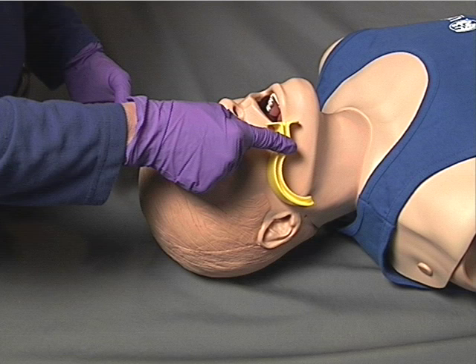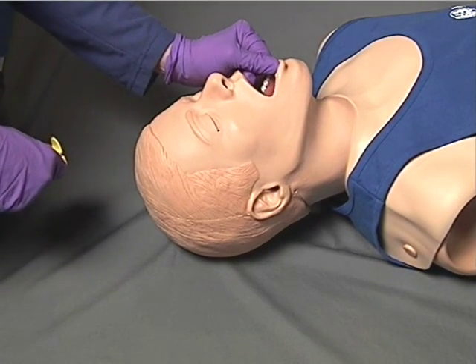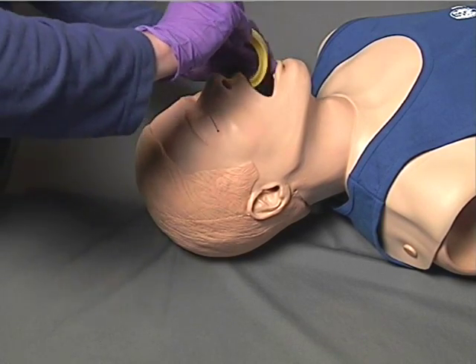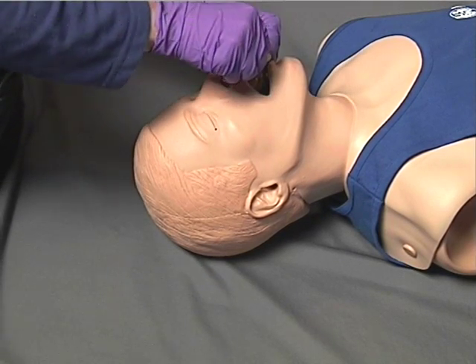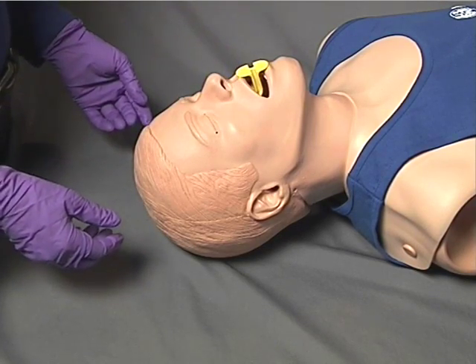Once the correct oral airway is selected, open the patient's mouth using a cross finger or scissor finger technique. The airway is then inserted into the patient's mouth with the tip pointing toward the roof of the mouth. Once the airway touches the soft palate, rotate the airway 180 degrees into anatomical position with the flange resting against the lips or teeth.